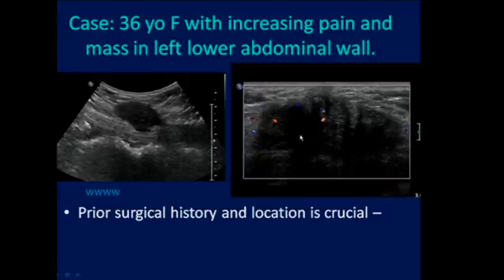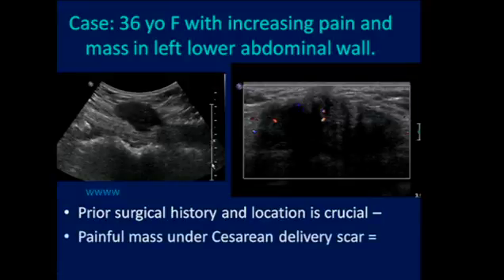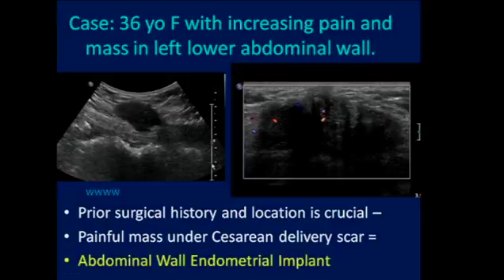This is a case where the 4 W's, that systematic approach, is really very helpful. We want to know what her story is. Has she had prior trauma? Where exactly is the location of this mass and her area of pain? Well, this is a painful mass under a cesarean delivery scar. This is someone with abdominal wall endometrial implant.